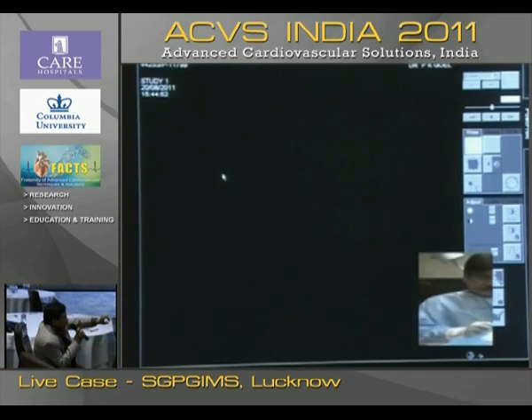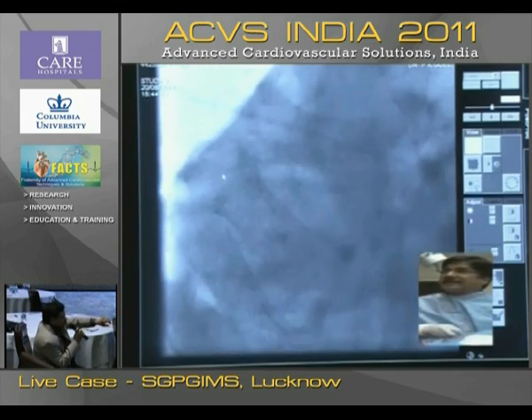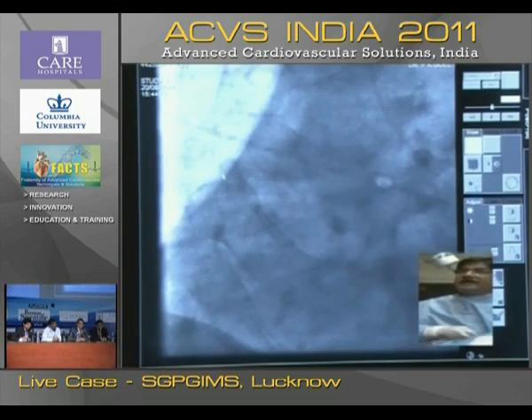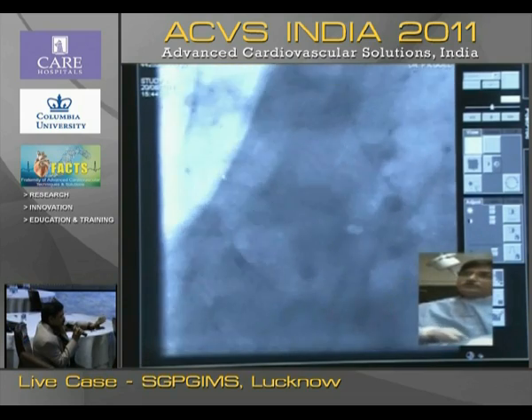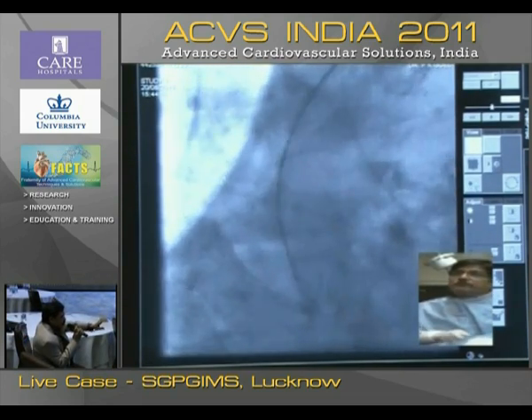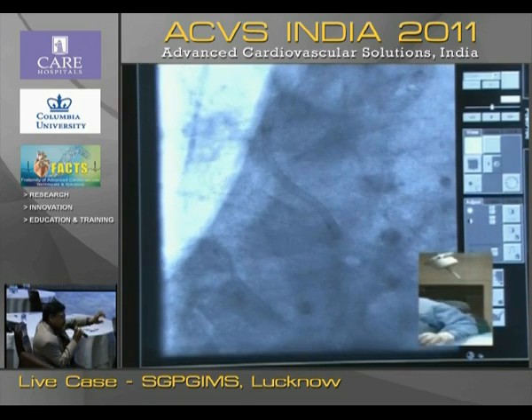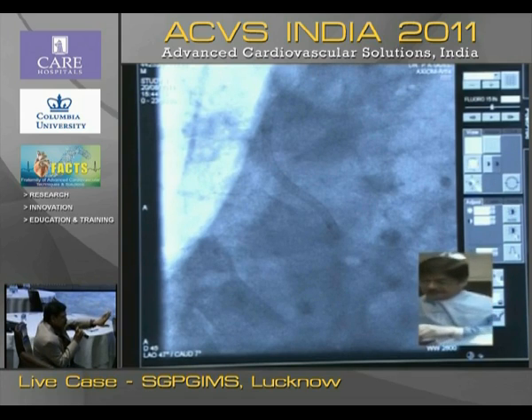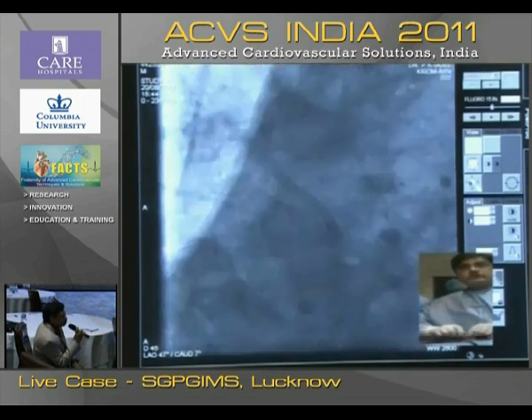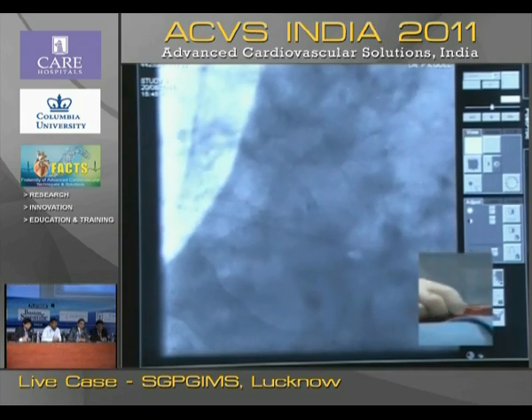Well, this one doesn't have side holes, but I'll see. The second thing, very important, is that whenever you have a micro catheter, the earlier one had side holes. To negotiate the micro catheter, first try a soft wire until you cross the bend, cross with a soft wire. Because if you put a stiff wire directly with a micro catheter, any stiff wire, the procedure ends there with a dissection at the proximal end. You cannot proceed further. It's a very important point in CTOs of the RCA.